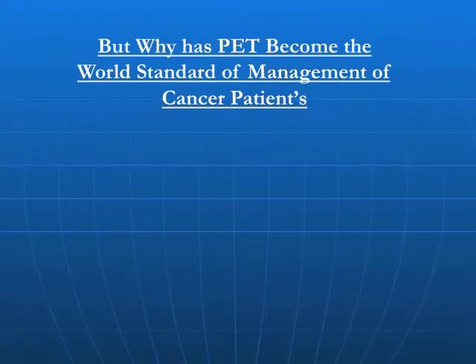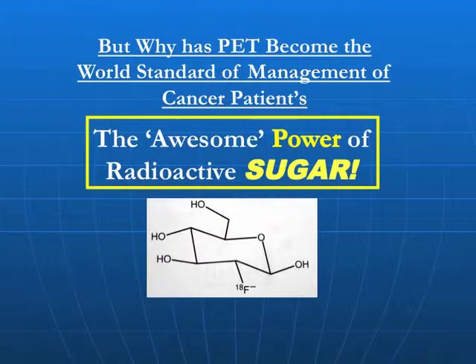Has PET become the world standard of management, in particular of cancer patients? There are lots of other uses as well, in cardiac patients to mention other things, but I'm just going to, for the moment, focus on PET scanning because that's by far and away the major use of PET scanning. The awesome power of radioactive sugar.